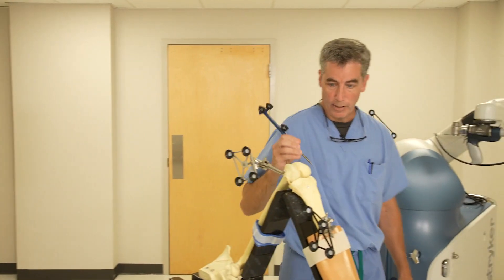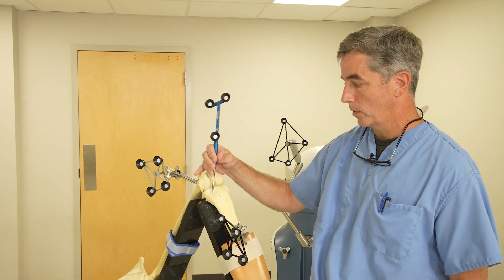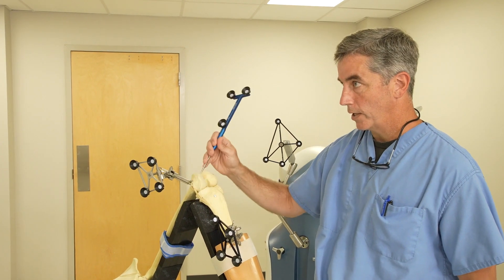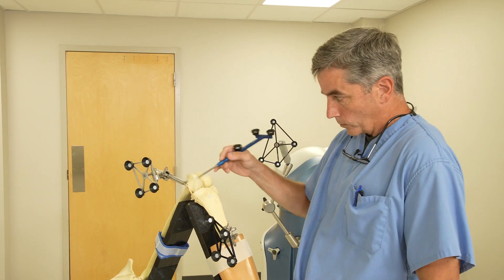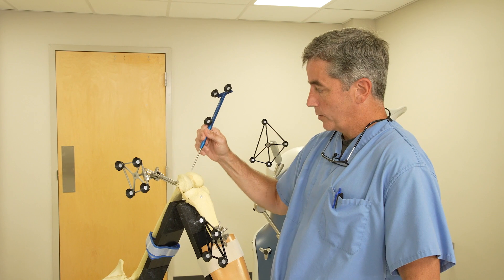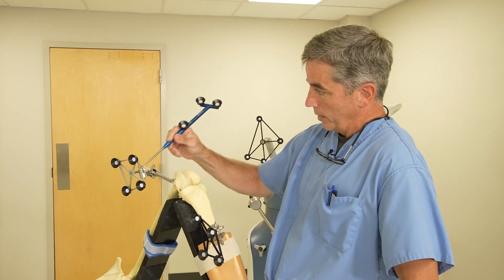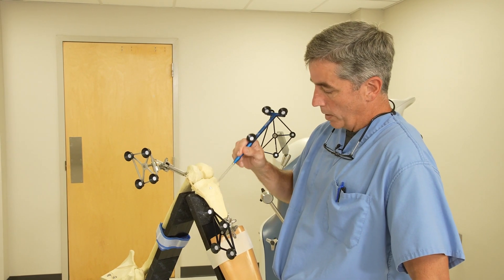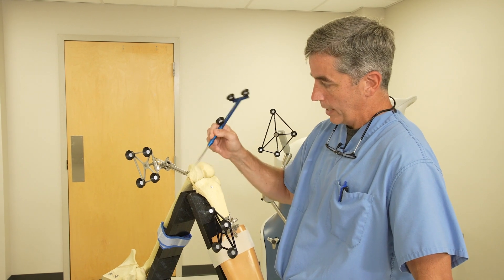Then we do the same thing on this bone, which we've already done — so we'll just pop the one bubble left. There we go. We've done the same thing on the shin bone. So now when the robot is cutting the femur bone, it's referencing the femur pin array, and when it's cutting the shin bone, it's referencing the tibial pin array, because each array is attached to its respective bone.